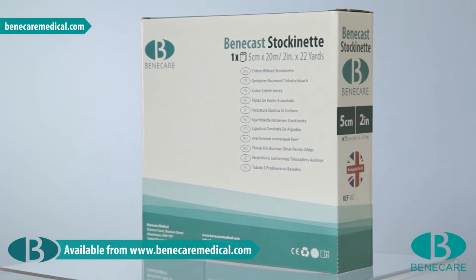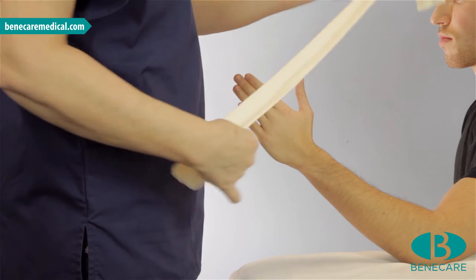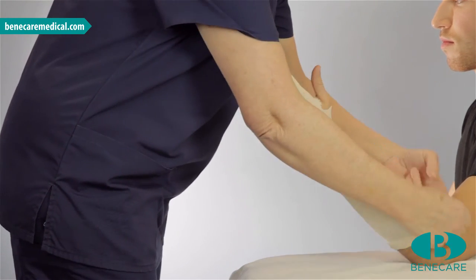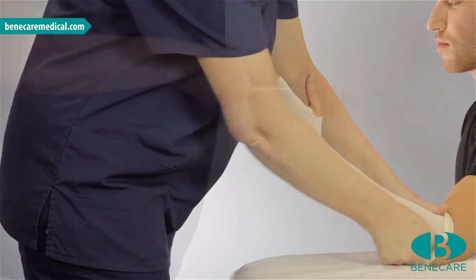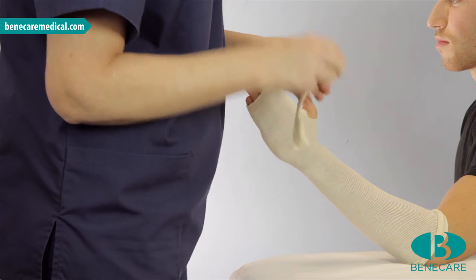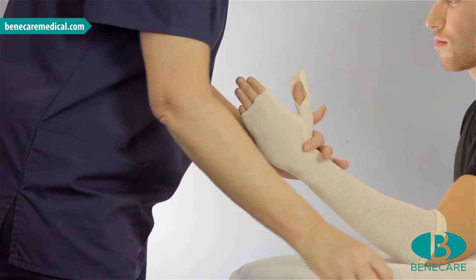Using the 5cm stockinette, make a small cut in line with the base of the thumb. Now apply to the limb, extending from the elbow to the fingers with the thumb positioned through the hole. Now using the 2.5cm stockinette, make a small cut at each extremity, then apply to the thumb, extending from the interphalangeal joint covering the thenar eminence.